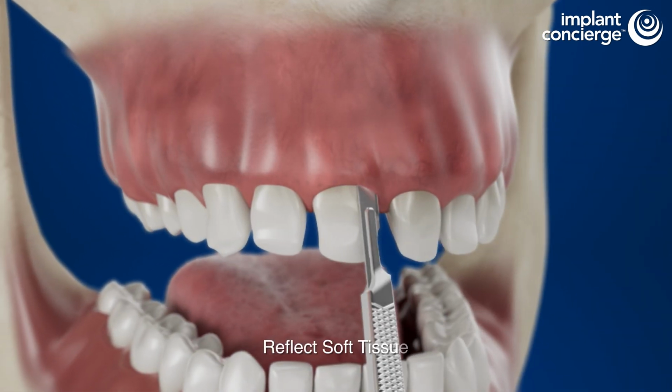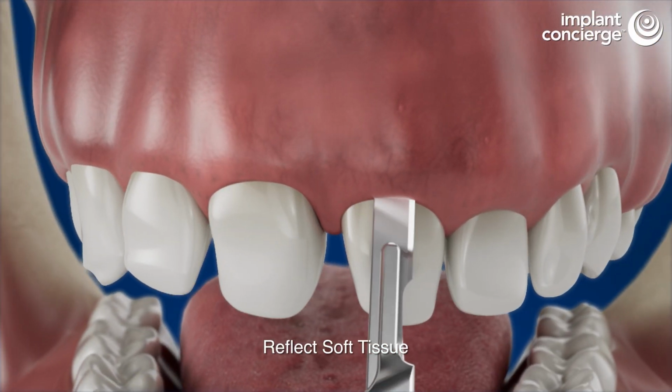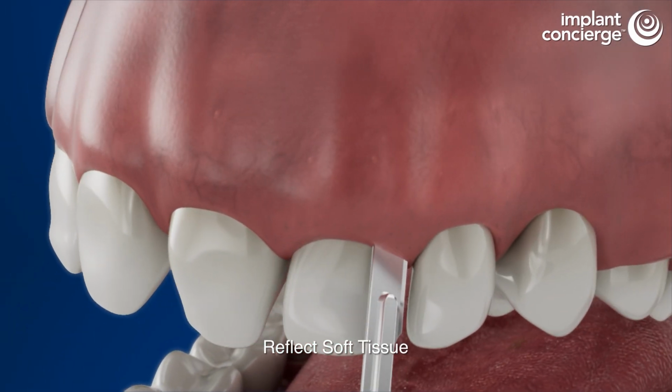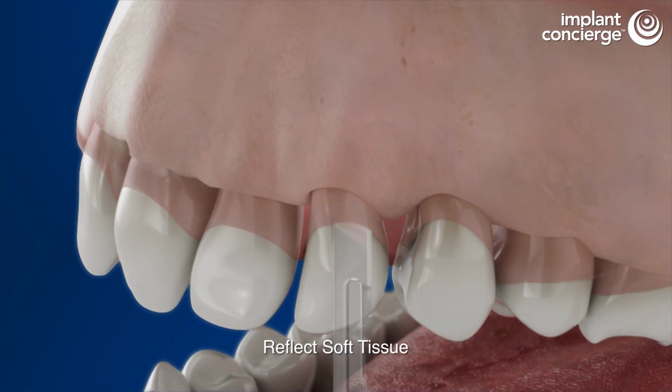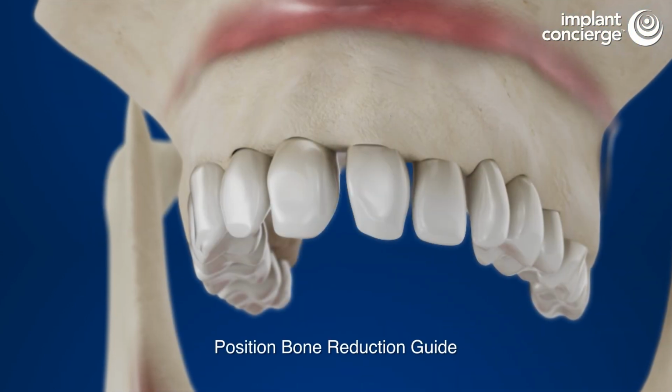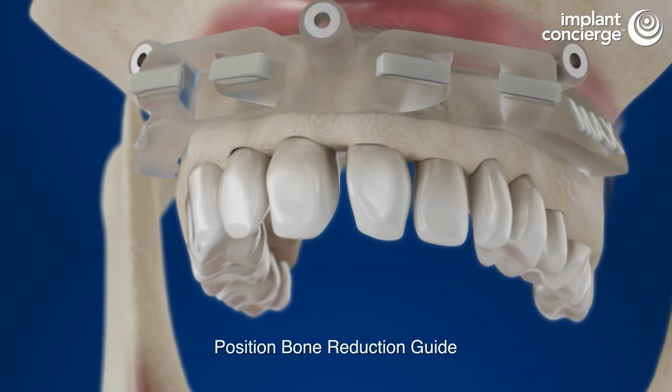Before initiating any extractions, reflect the soft tissue from the buccal alveolar bone, extending apically to guarantee proper seating of the bone reduction guide. Position the bone reduction guide directly to the buccal bone anatomy.